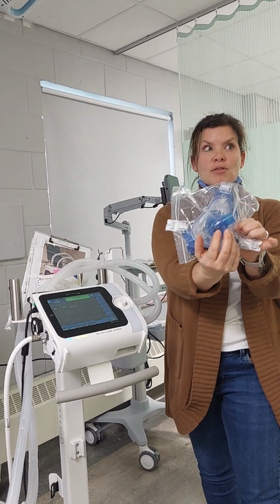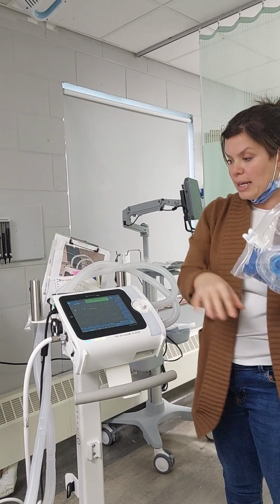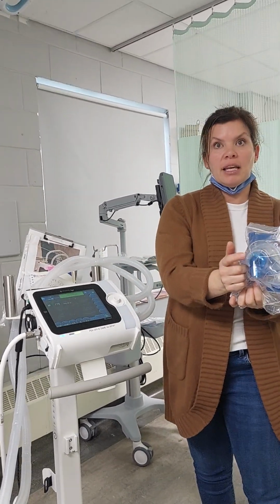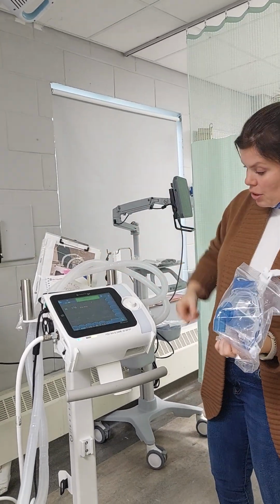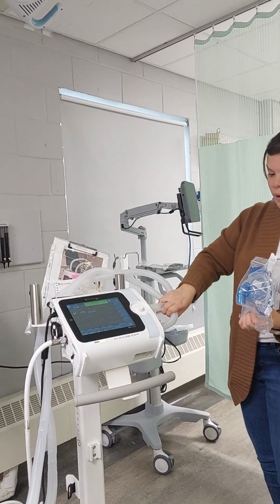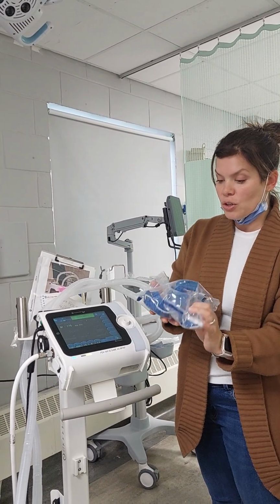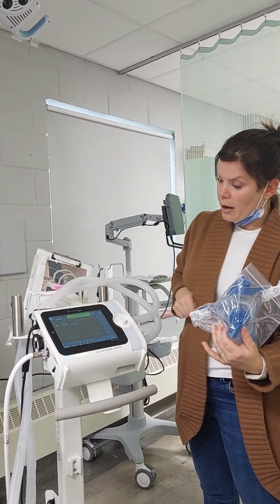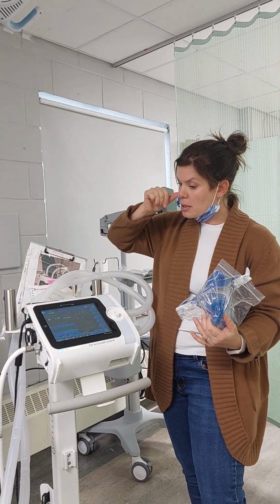These masks, what's different from the other ones, like the box or the ones that are just CPAP, BiPAP, is that they'll have a vent for the patient to breathe out. You don't need that with this because you have it here. It just goes through your tubing. So you need a closed mask. This is what you're using, and you can use it for CPAP or BiPAP. When you go there, say okay. It's going to start.